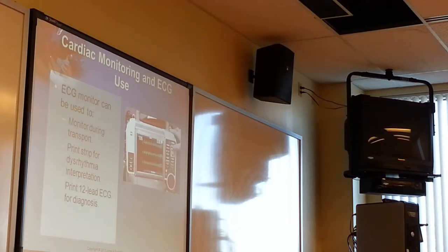And Sherry brought up the same cases. Do you always believe what the 12-lead monitor, what the LifePak 12 or LifePak 15 tells you is the interpretation? No. Because they could be totally wrong. I think it says STEMI like 40% of the time. And that's coming from the guy from Physio. Right. You're exactly right. And it goes back to my comment: treat the patient, not the monitor.